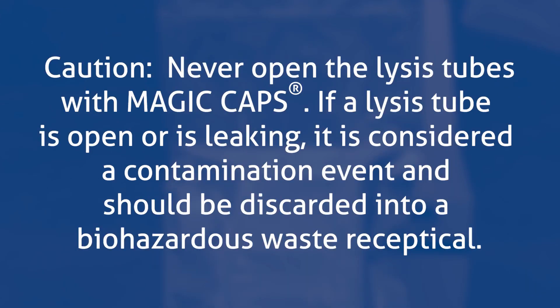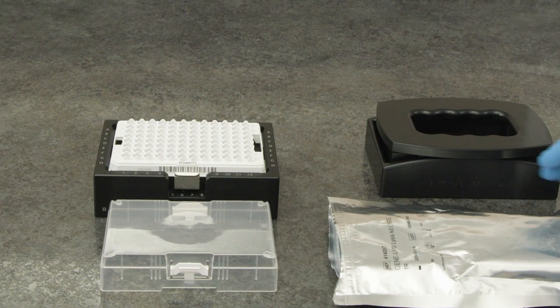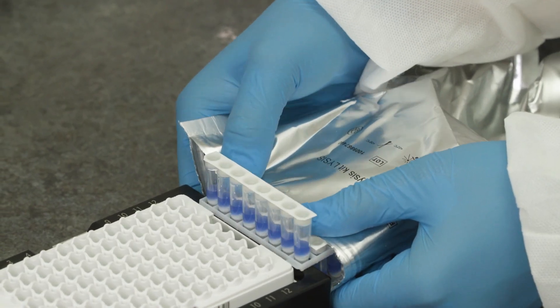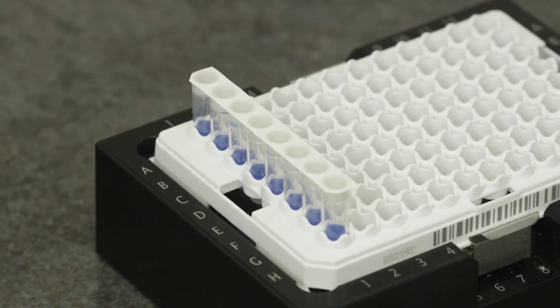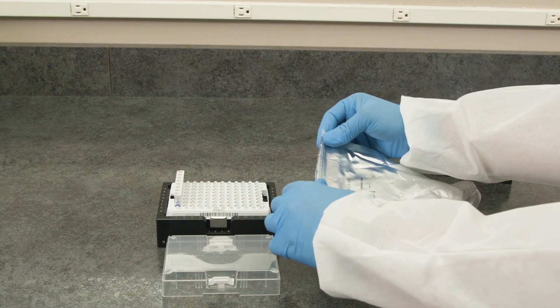Never open the lysis tubes with magic caps. If a lysis tube is open or leaking, it is considered a contamination event and should be discarded into a biohazardous waste receptacle. Place the lysis tube holder into the heavy rack holder with the notch oriented in the H1 position. Aseptically remove the lysis tubes from the bag by pushing them out instead of reaching into the bag to pull them out. Remove the required number of lysis tubes from the rack using the edge of the heavy rack holder to push them out. Place a lysis tube for each sample in the GeneUp lysis tube holder according to the plate map. Note: if less than 8 tubes in a strip are required, the strips can be cut apart and only the used tubes are placed in the holder. Return any remaining lysis tubes to the foil pack and place back into the kit box.